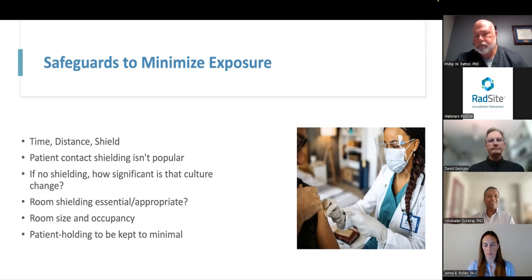Yep. Totally agree with that. So obviously, the practice would be like anything, that's just the way we do it in CT. If the patient is adamant about getting some shielding, for example, if there is a pregnant patient getting a chest or a head CT, yeah, if that's the case, you can just provide them that. But either way, the benefits or the negatives are negligible. So thanks for that, Dr.